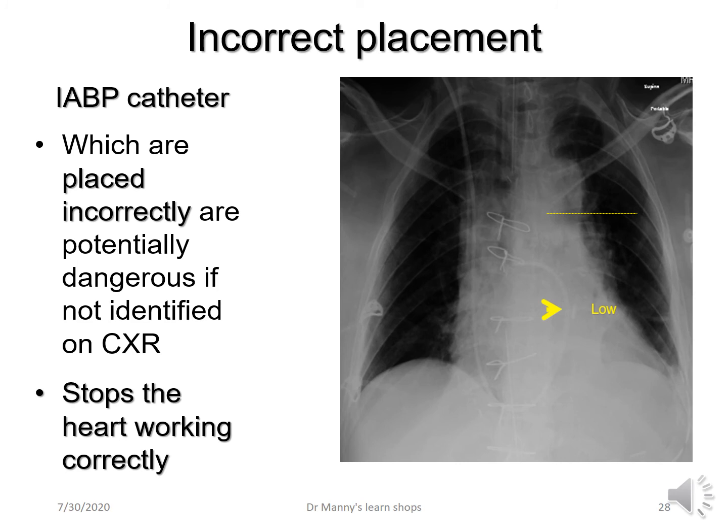But on the X-ray that you're viewing here, the catheter is placed too low. You can see the radio-opaque tip, and this would have an effect lower down on the renal arteries. Or if it's too low, the catheter may not be doing what it's supposed to be doing, helping the heart. It's supposed to be in the right position.